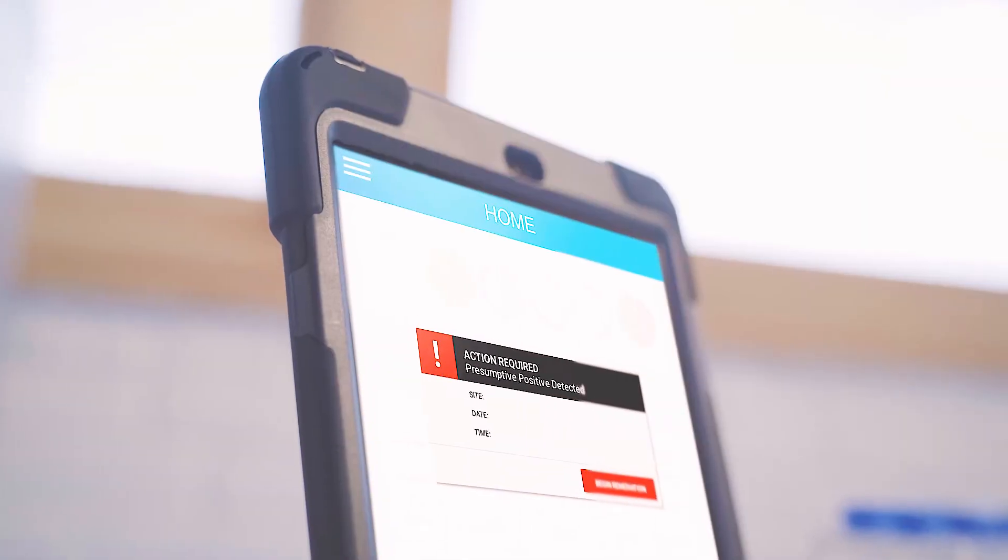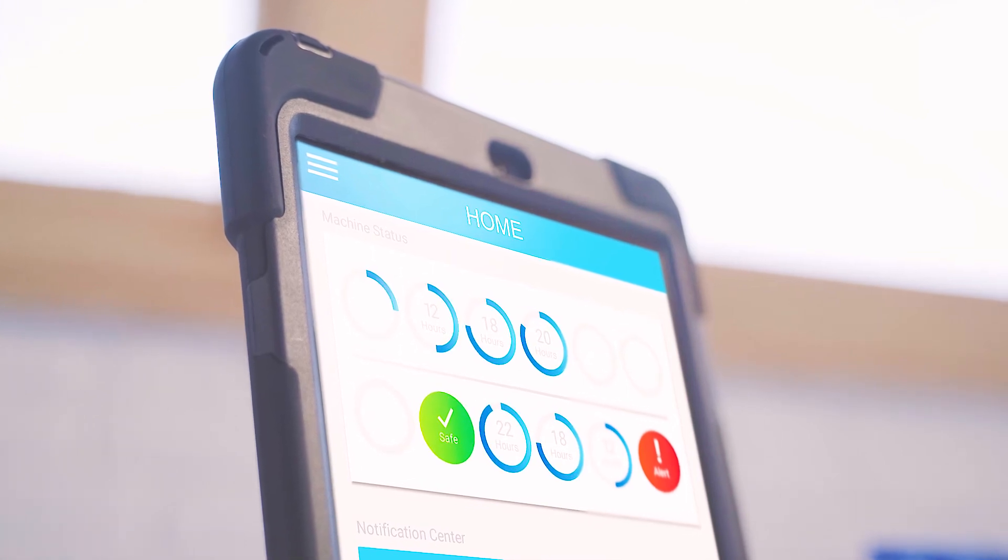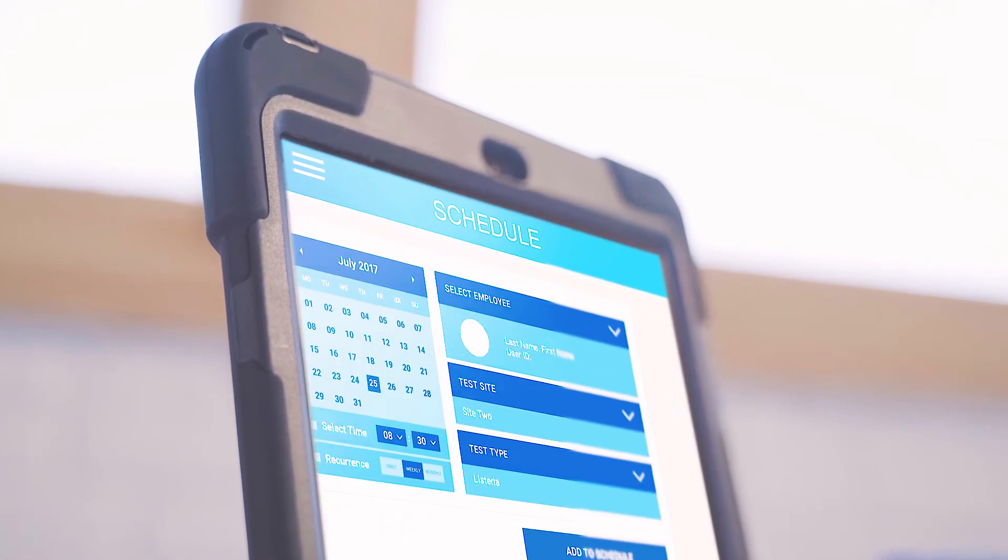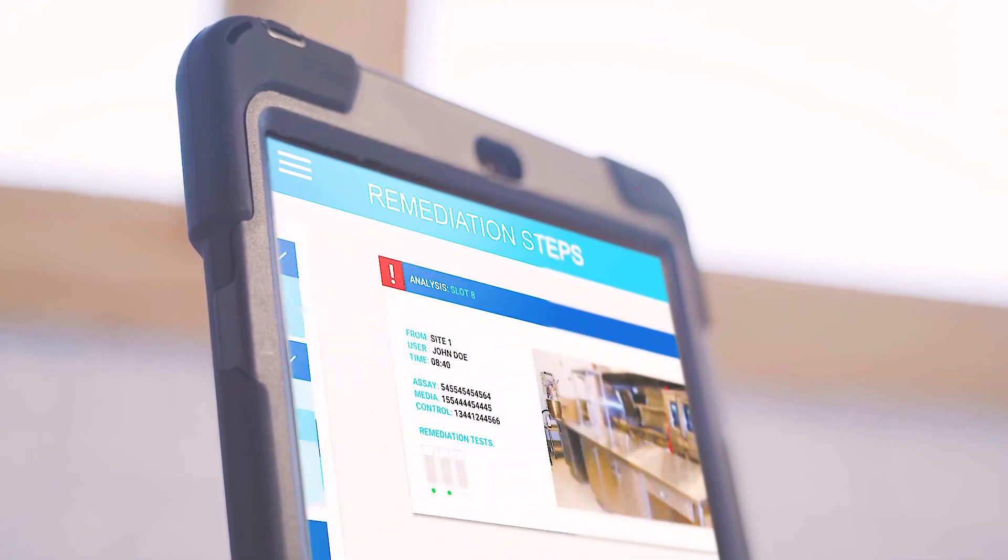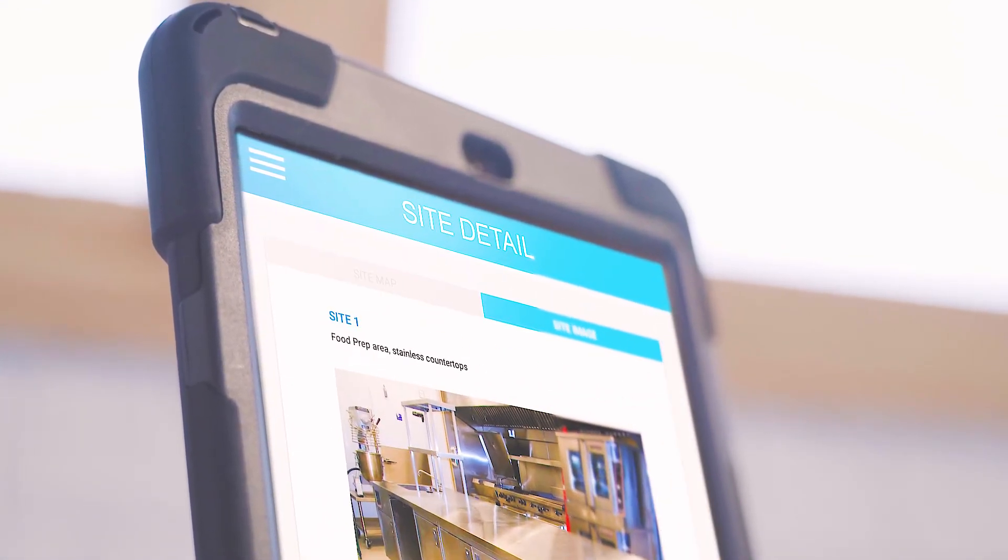The control pad prompts critical sanitation remediation steps, while the presumptive positive sample can be sent for external lab confirmation testing. Facility management software features include scheduling, mapping, trend plotting and remediation management.